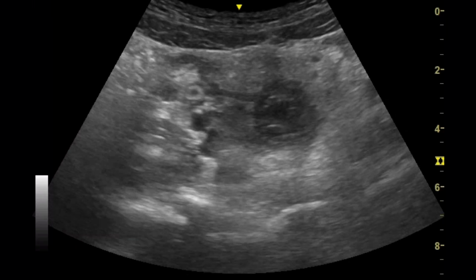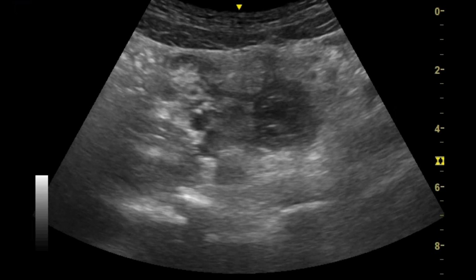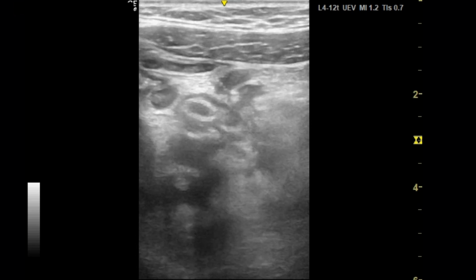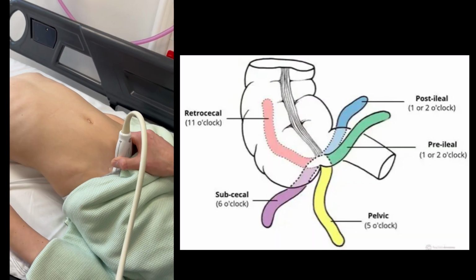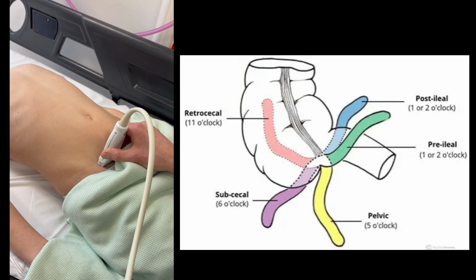And then the next image will show the high frequency probe images, which was in fact an inflamed appendix. There it is, we can see the highly echogenic surrounding omentum and the fixed tubular structure. So this is actually me scanning my son's abdomen, who we noted had a very easy to find appendix when he attended for one of our ultrasound courses.